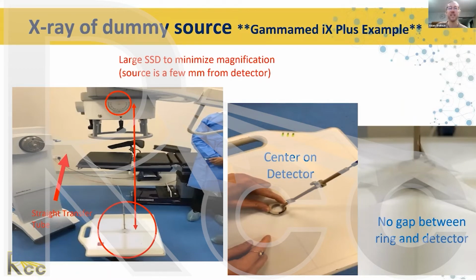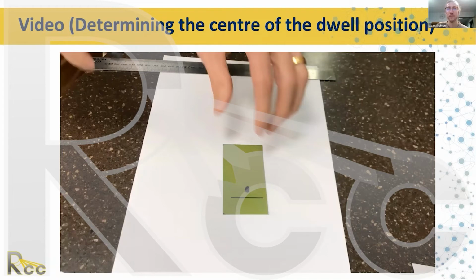Just a note on radiation safety, it's also nice to have your afterloader locked to a wall with a chain cable, something like that. Usually diagnostic will be willing to come over for an hour or so and just help you take a couple images, and then they'll be able to transfer those images to you. But good question. Thank you.